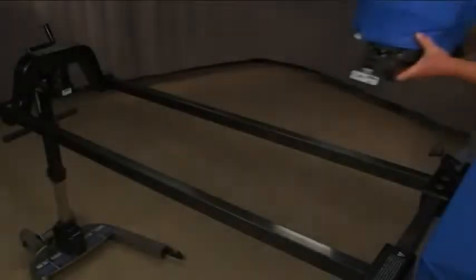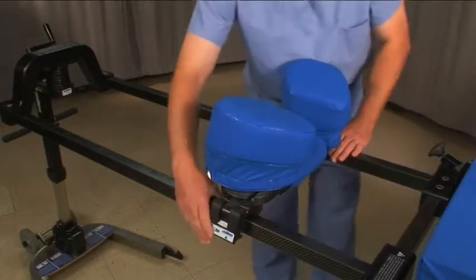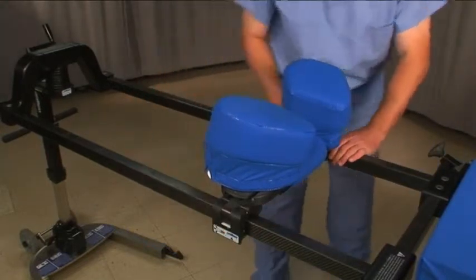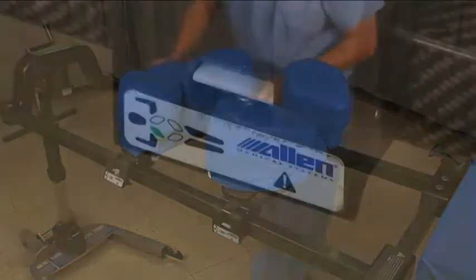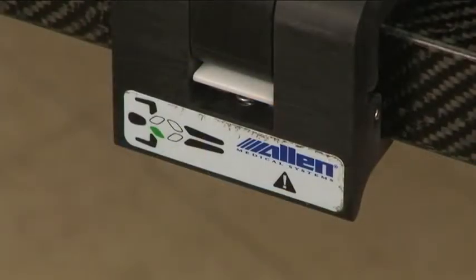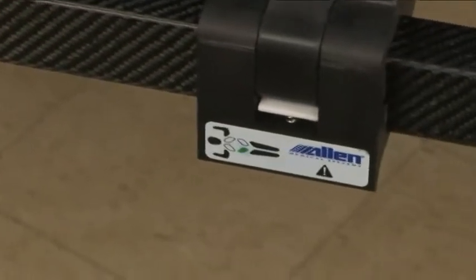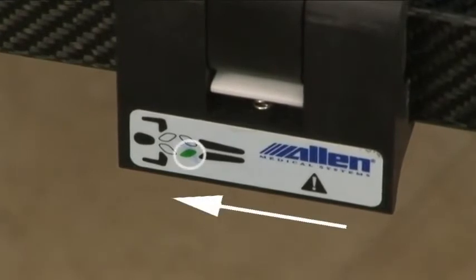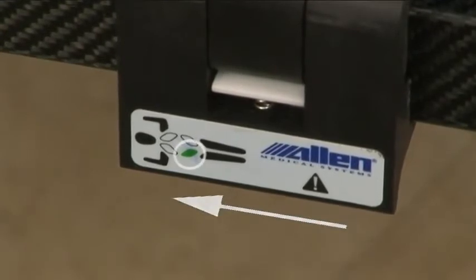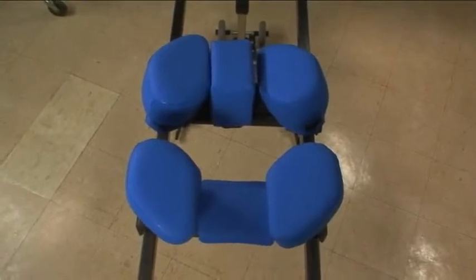The Wingset system supports the patient's torso in the prone and lateral positions. It consists of a hip piece and a chest piece. Each piece is unique. The label on each latch indicates the proper orientation — the figure's head should be pointing in the same direction as the patient's head, and the solid colored quadrant differentiates the hip and chest pieces. If everything has been installed correctly, the Wingsets should form an O.